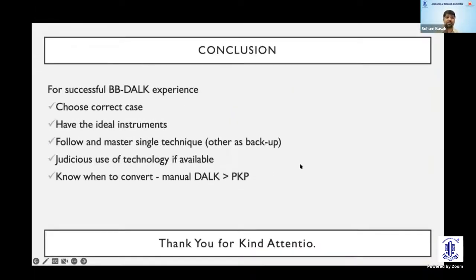So finally, for a successful big bubble DALK experience, choose the correct cases, have the ideal instruments, follow and master a single technique, ideally initially, and later you can learn the other techniques as a backup. Judicious use of technology if available, and of course you should know when to convert to manual dissection, because always doing a DALK is better than doing a penetrating keratoplasty.